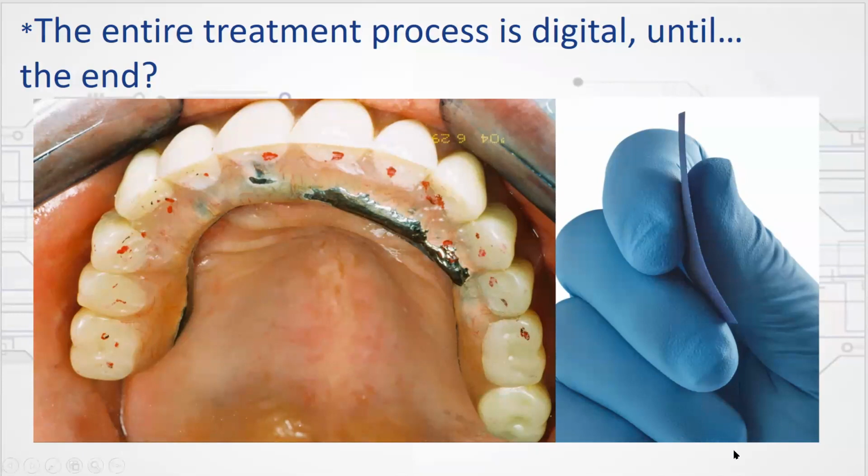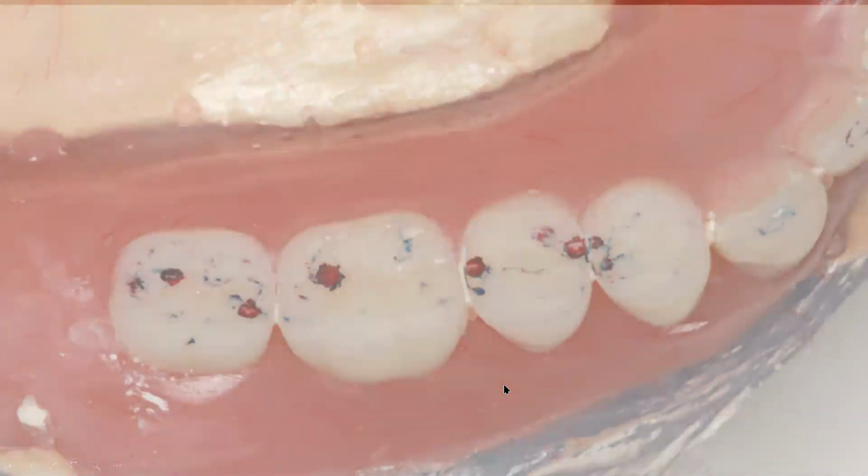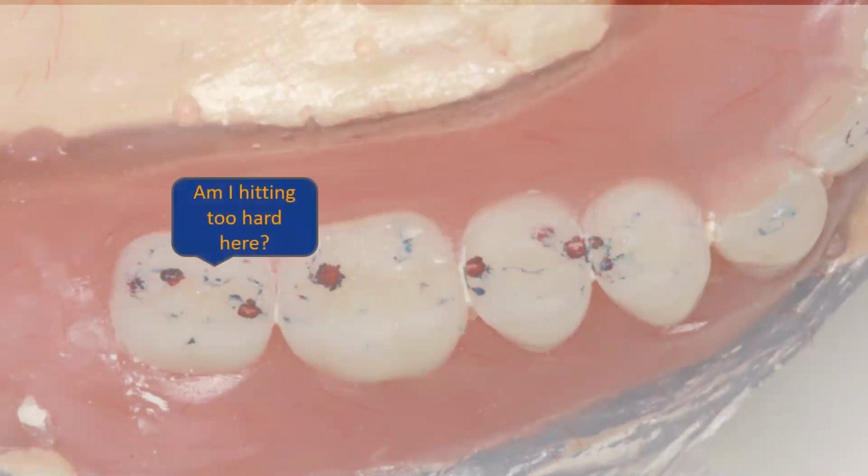And so the question becomes, what can you see in this material? Well, a better question is actually, what can't you see? Because that's the real problem. What's missing, the information that's missing. So here's some of the things that are missing. Is this contact forceful? Am I hitting too hard here? And the reality is the size of the mark has nothing to do with the applied force. And actually, the smaller the mark, the greater the pressure.